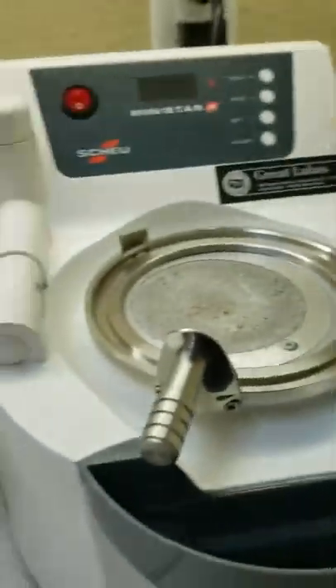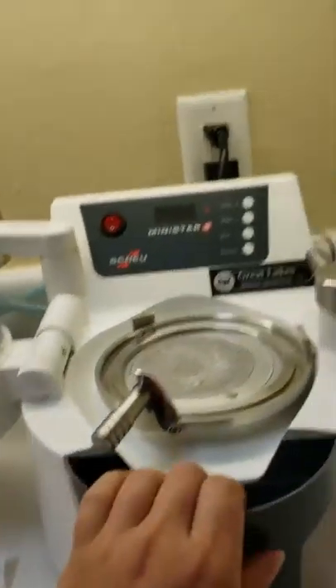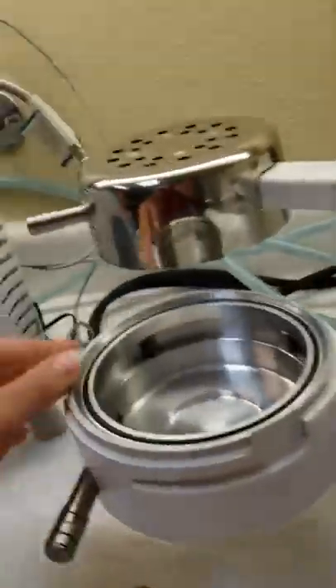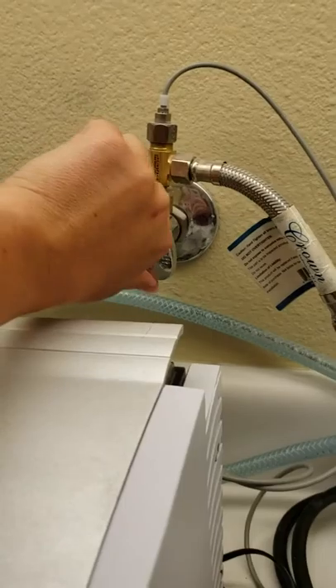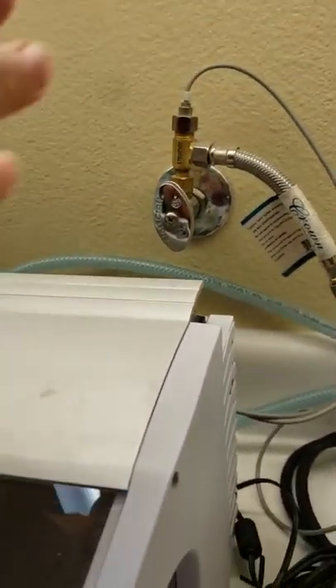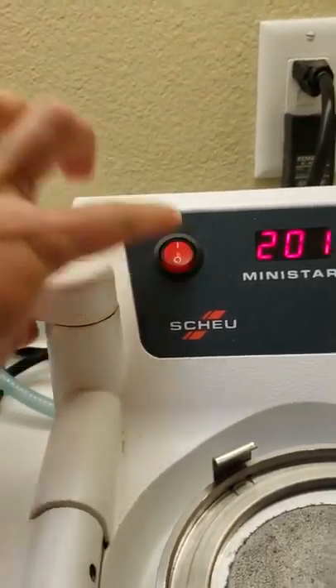Now we're setting up the Ministar. The first thing I usually do is make sure it's pulled away from the wall, because the top part gets super hot and you don't want it to hit any wires back there. This valve just needs to be opened about a half a turn — it doesn't need to be opened all the way.